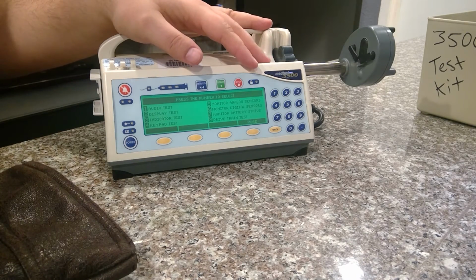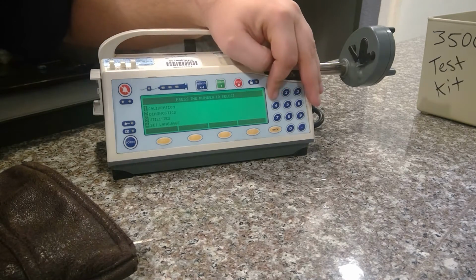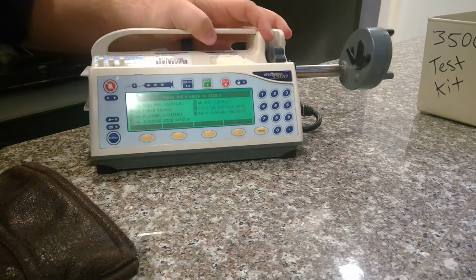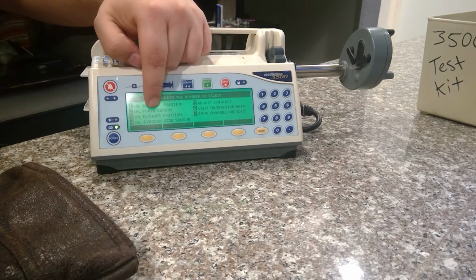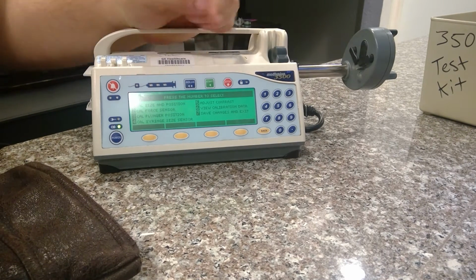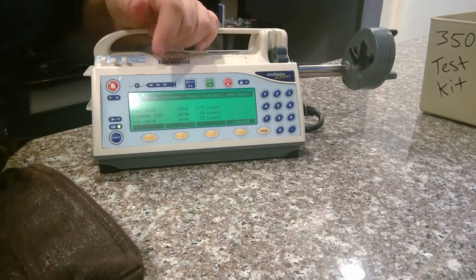Okay. Next step would be calibration. So go back to the main menu on biomed mode. Go to calibrate. You have 4 different options on this side. The only 2 you want to do is cal position and size and calibrate force. The other 2 are basically 3 and 4 combined into 1. So first one is 1. It's going to do your low standard.